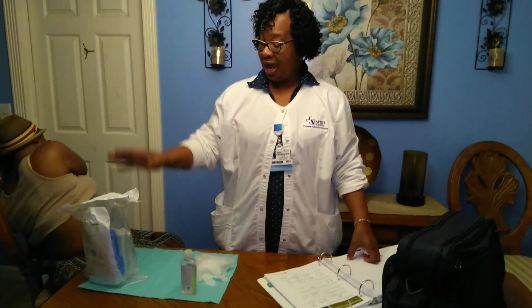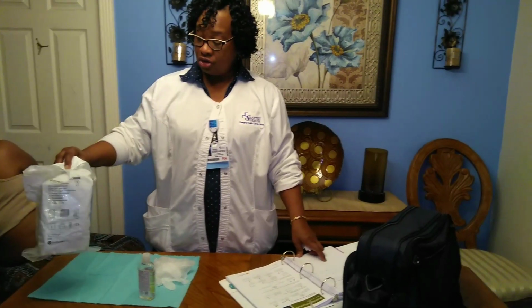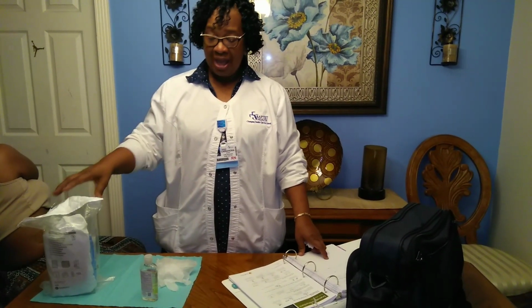Pleurx drain. What you want to make sure is that you have everything available that you're going to need before you actually go out and do the patient's visit. Make sure your supplies are readily available, that you have your Pleurx drain kit, and the instructions in order to drain the patient. The orders from the physician of how much they want you to drain and how often. It should be written instructions from your physician.